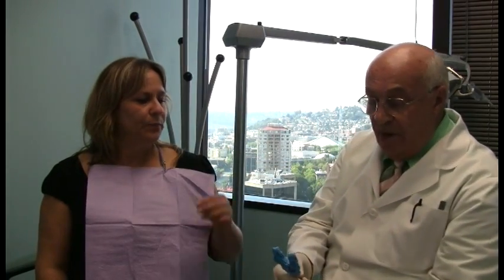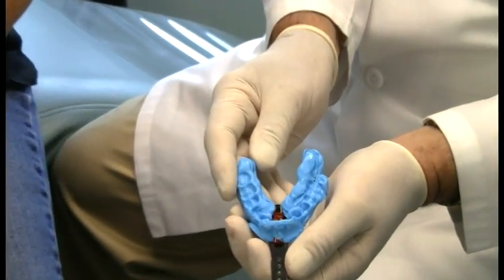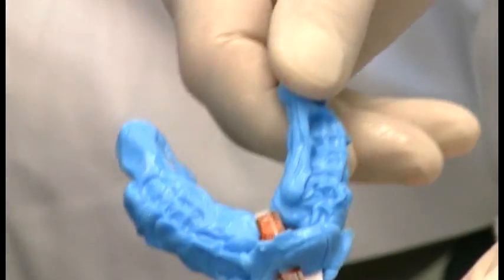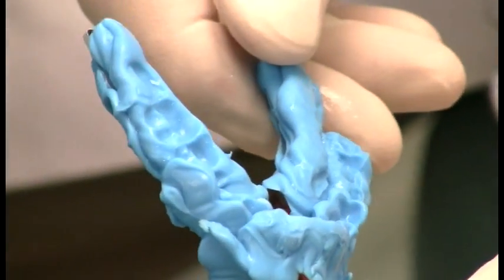Okay, so now if we can bring this in close here. Now this is uncut, untrimmed, so the tooth notches and imprints in here are much more significant.